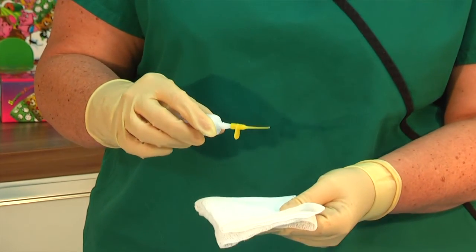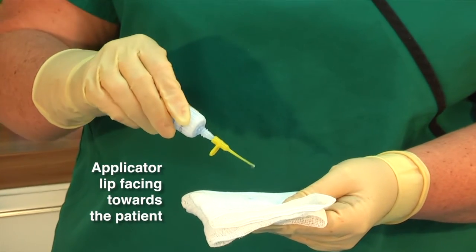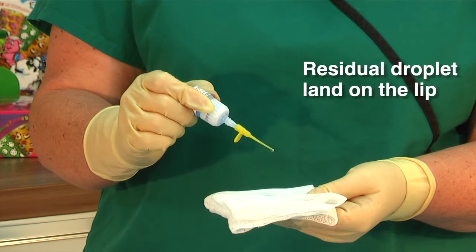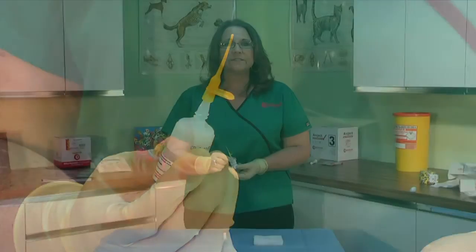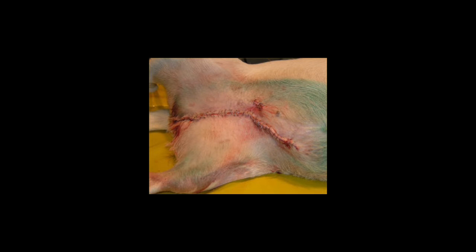Just a little tip: I like to place the lip of the applicator facing towards the patient, because when I've applied the glue, if there is a residual droplet it will land on the lip rather than running down the bottle which could cause a mess. Dermafuse can also be used between stainless steel staples; however, the application of adhesive on staples may sometimes interfere with staple removal.